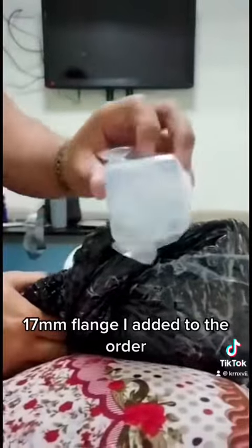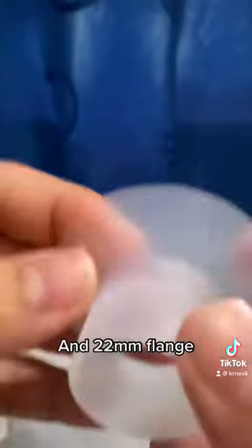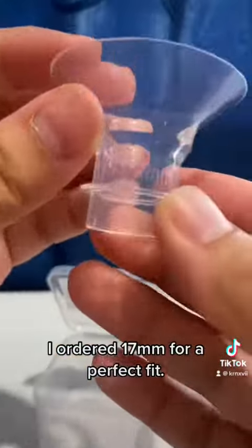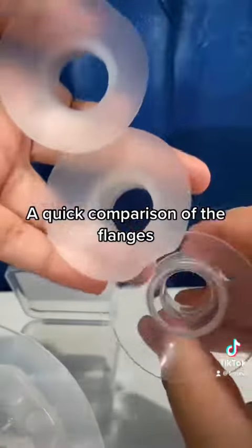17mm flange I added to the order. The pump includes two flanges: a 20mm flange and a 22mm flange. I ordered the 17mm for a perfect fit. Here's a quick comparison of the flanges.